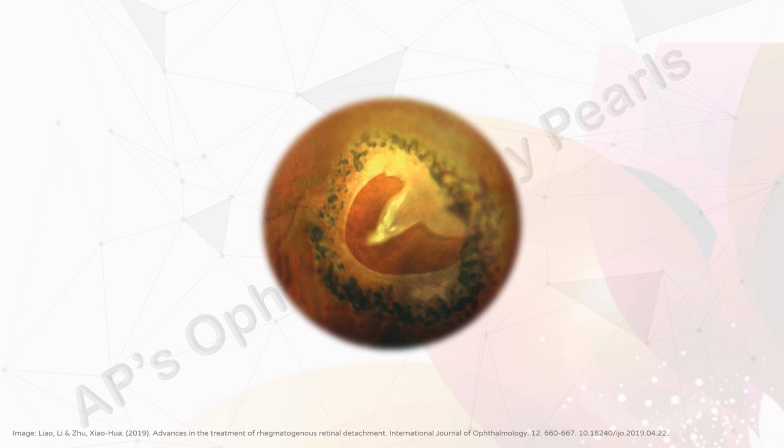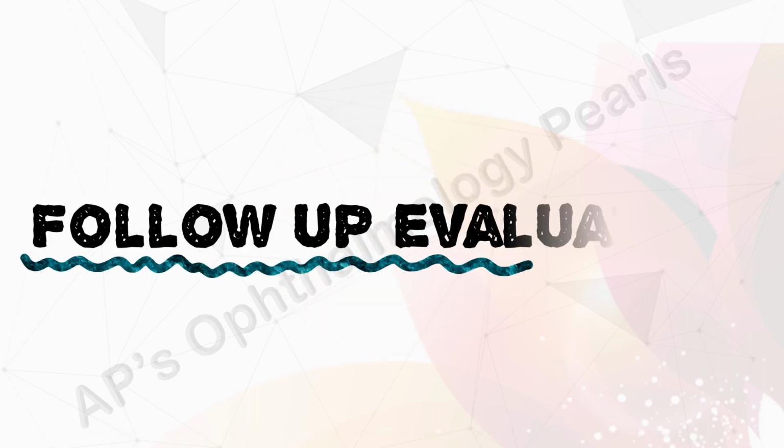The laser beam should avoid the pathway of vitreous attachment to the operculum. The operculum of the horseshoe tear should not be photocoagulated.